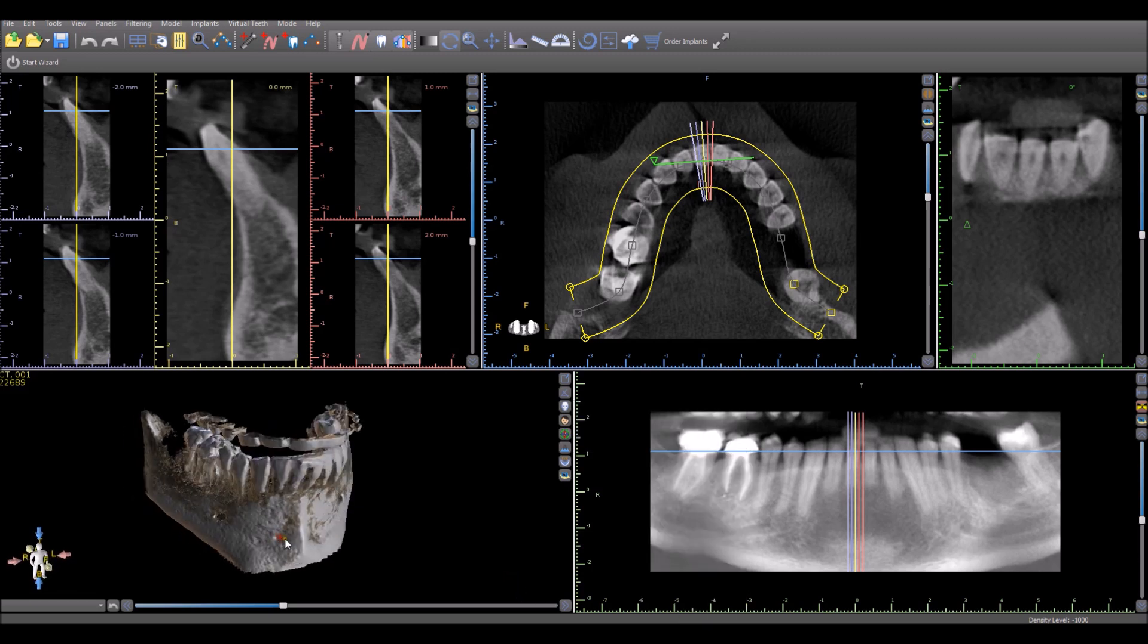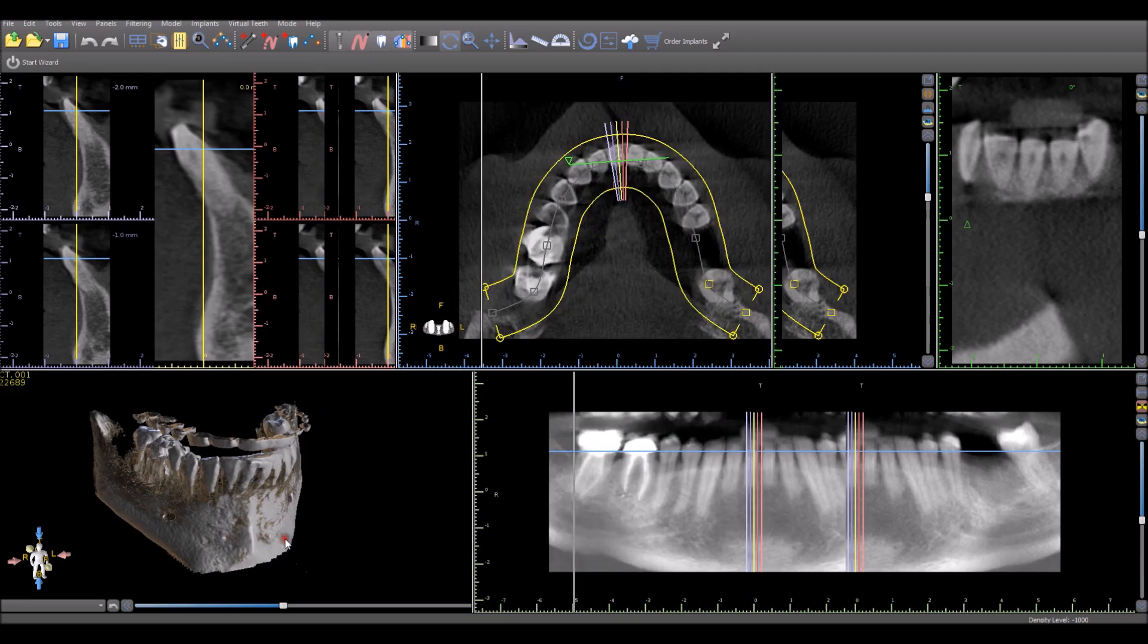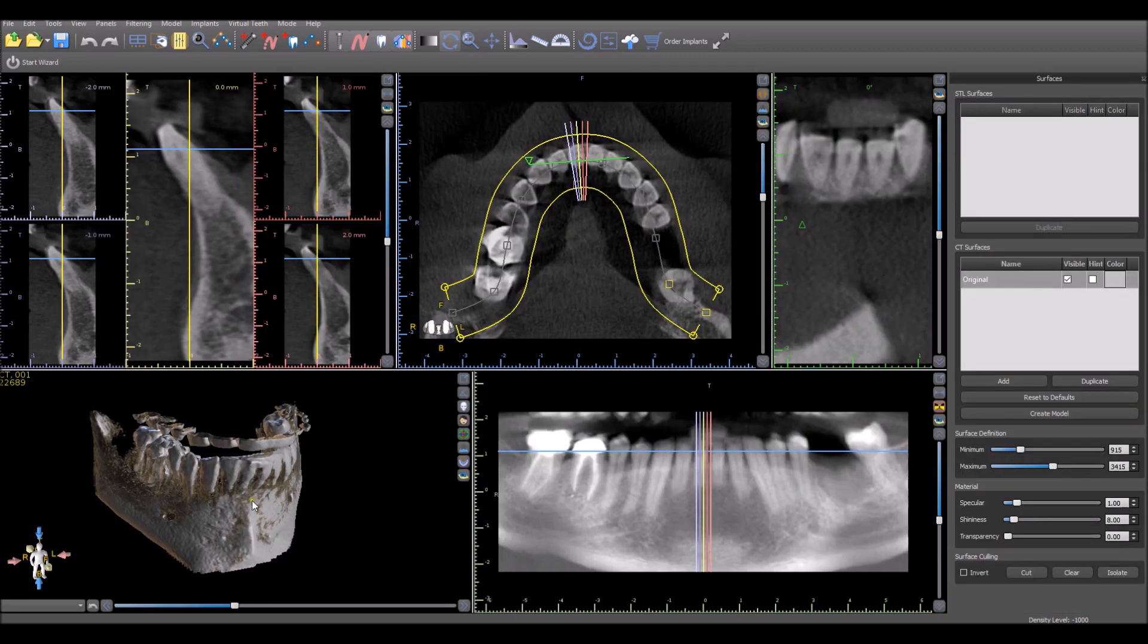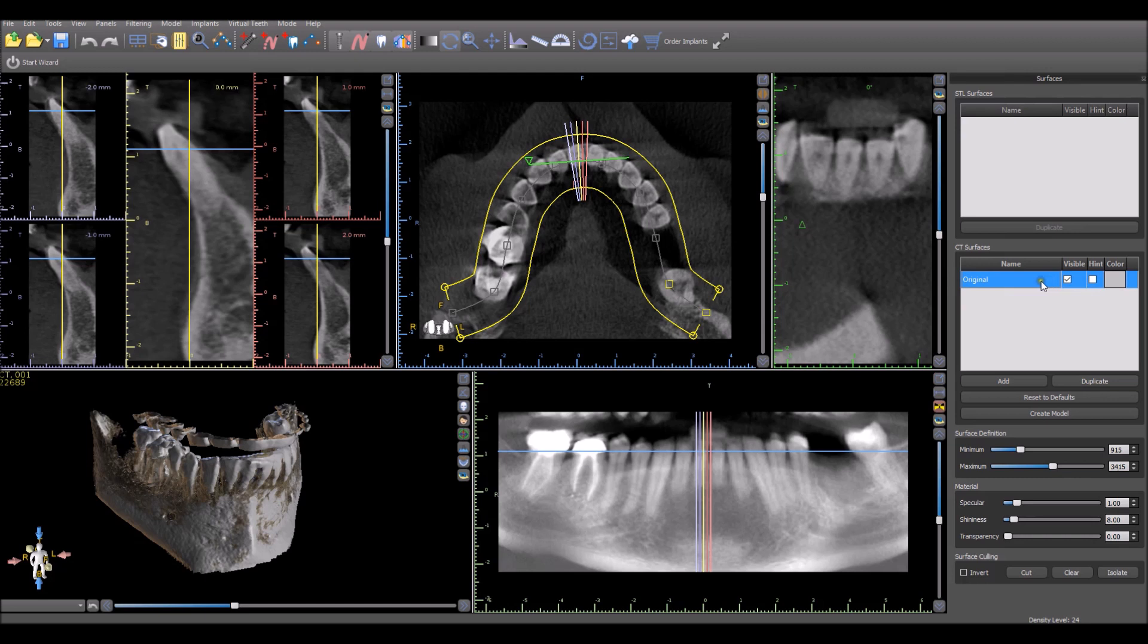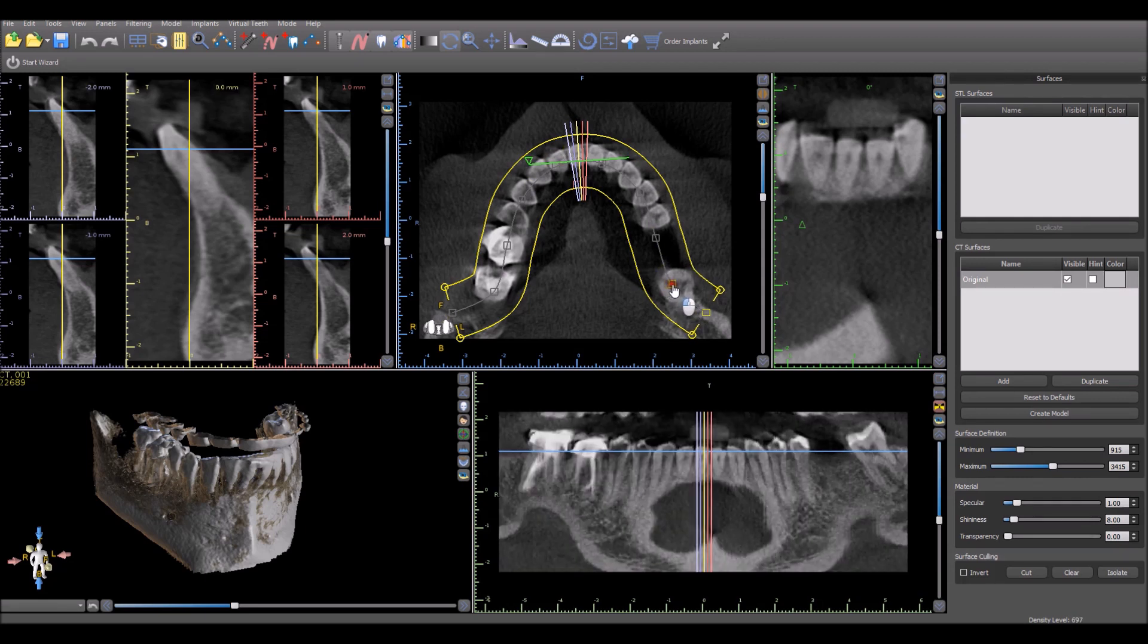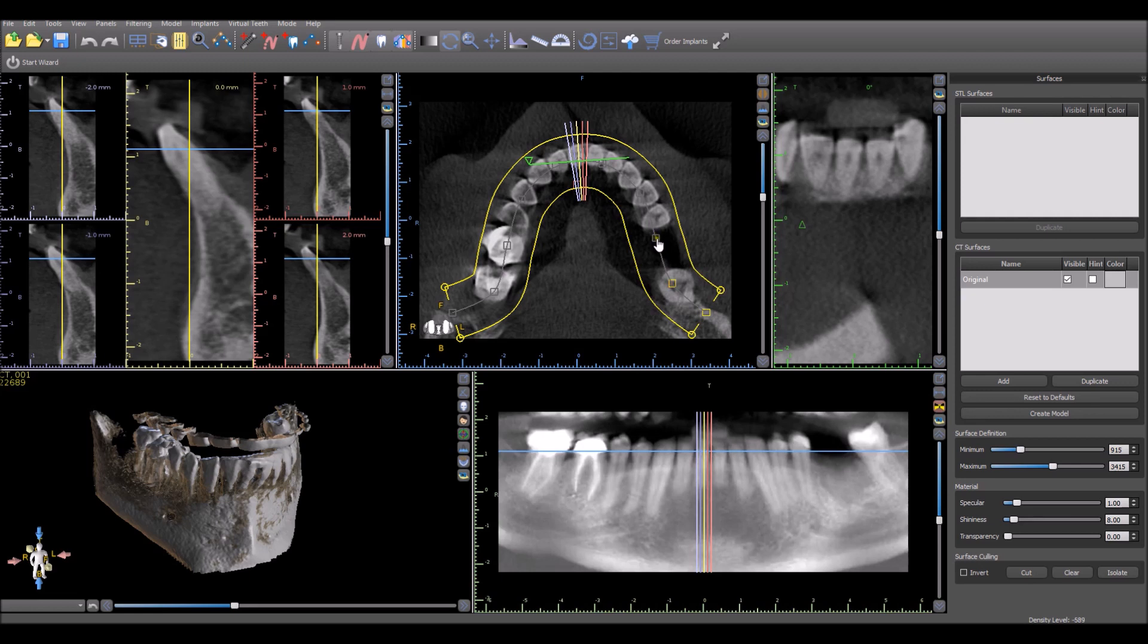Double clicking on the 3D view will open up our Surfaces panel. Right now our CT scan is the only one listed there. If we import the model or anything else, it will appear there as well. We can see that the panoramic curve in the axial view is automatically drawn. If we want to make any modifications, we can grab any of the squares and make modifications.